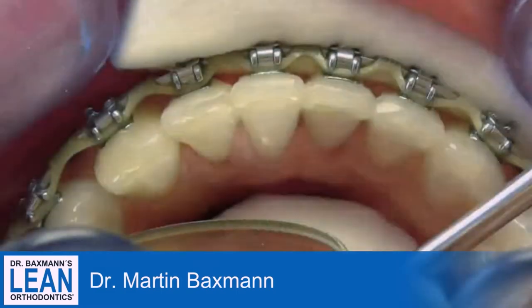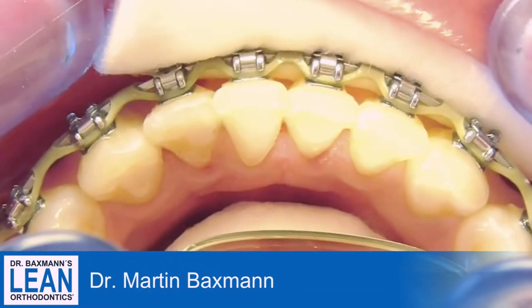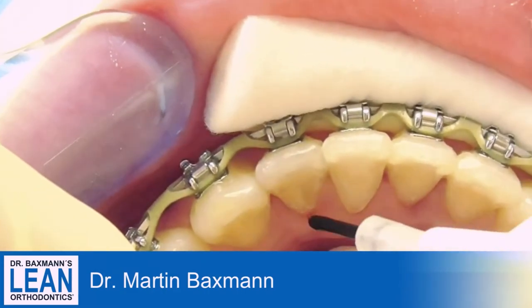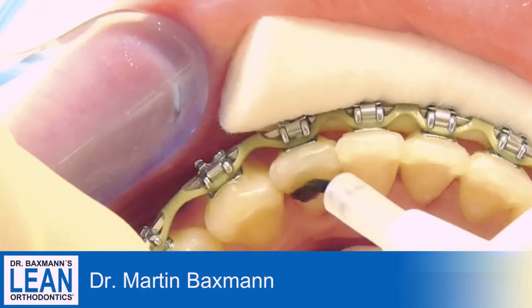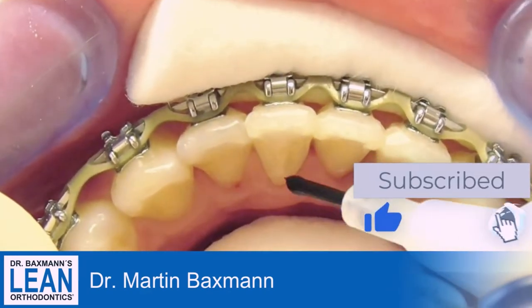After you've cleaned them, make sure you have a dry field. Do your etch with your phosphoric acid. After that you wash it off, dry it, and bond it as you usually would.